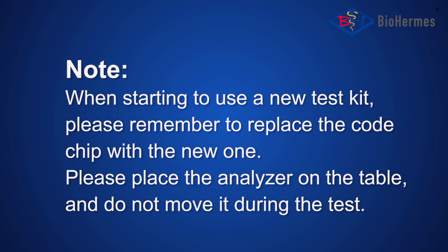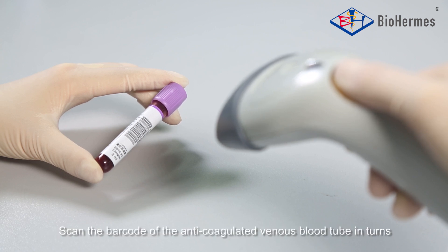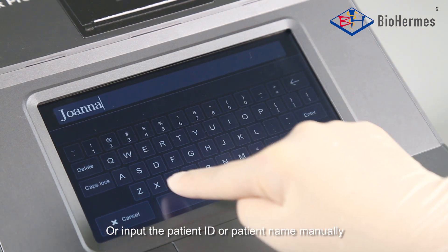Please place the analyzer on the table and do not move it during the test. ID Input: Connect the barcode reader to the analyzer via USB or RS232-C interface. Scan the barcode of the anticoagulated venous blood tube, or input the patient ID or patient name manually.